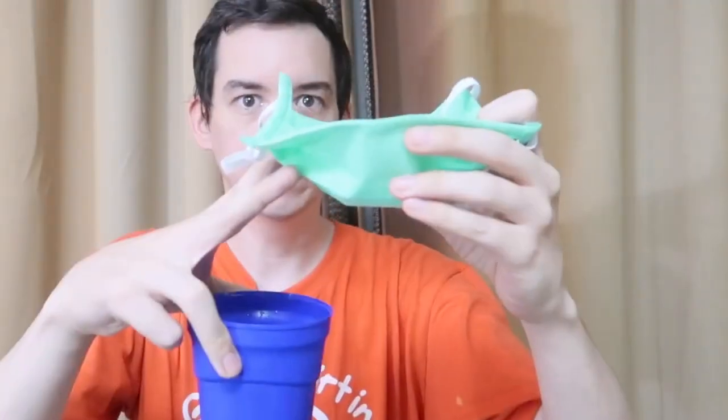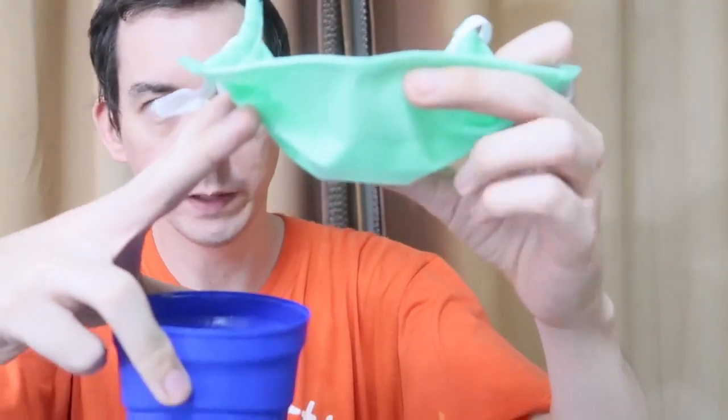But we do have other masks — like this one for example — and you'll see it can pass the hydrophobic test. So there are masks out there that are hydrophobic and will prevent water from passing through.